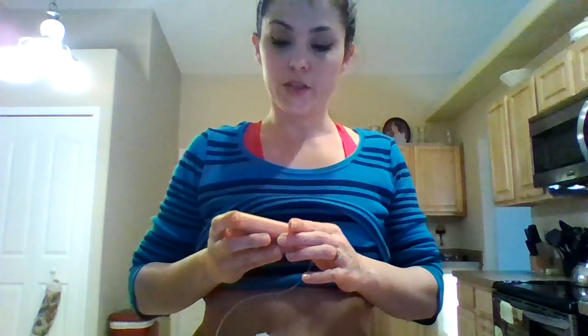And it says connect new sensor, then press Act or escape to abort. I don't want to abort, so I'm going to press Act. And now it says sensor ready, 2 hours. Alert will sound when meter BG is required. Press any key to continue.